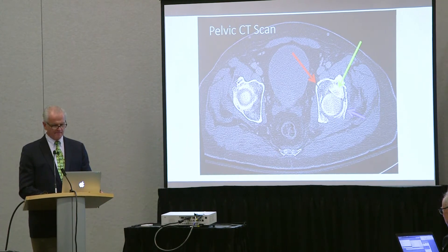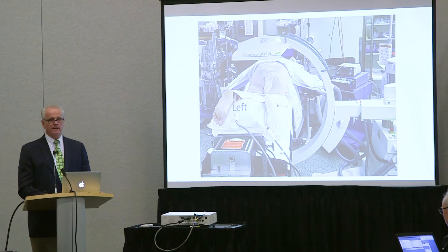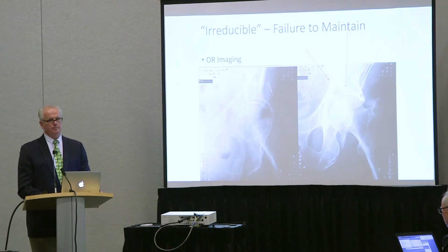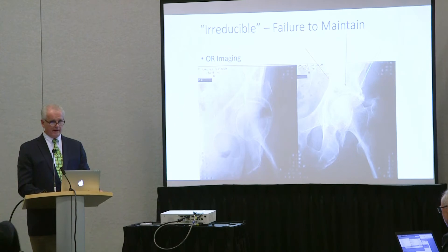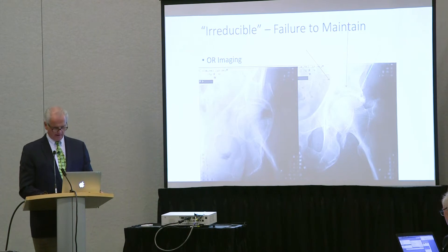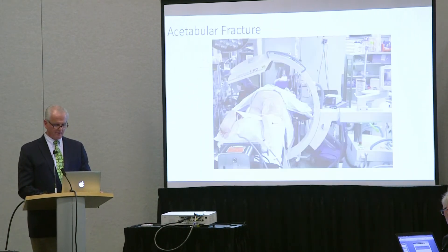This is the preoperative scan. In the operating room, we decide to do a Kocher-Langenbeck, and we turn him prone. When we put the C-arm on him, it looks like this — now he's reduced. He's been relaxed and put prone, and now the head is beneath the intact dome. I don't know what just happened, because there was an attempted reduction that didn't work, and now just by relaxing him and putting him prone he's reduced. I don't know if there's debris in the joint.